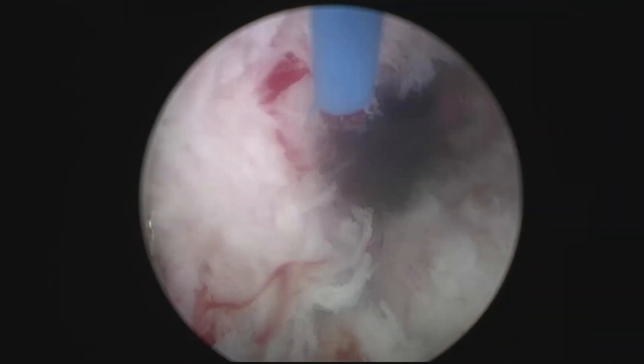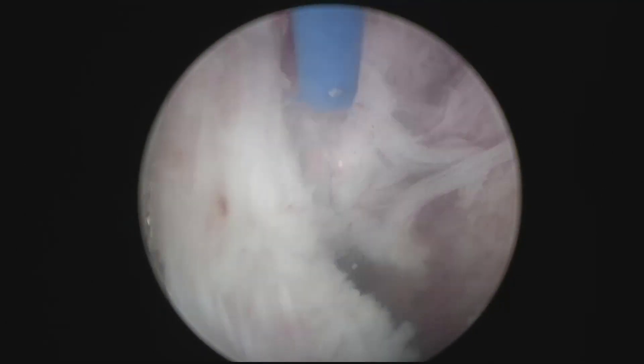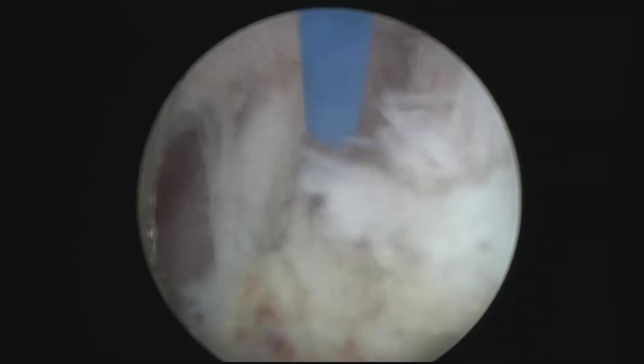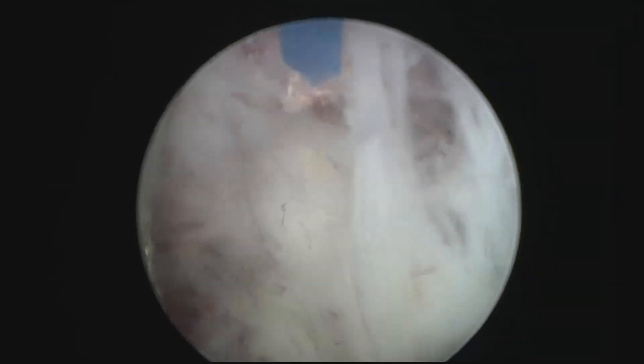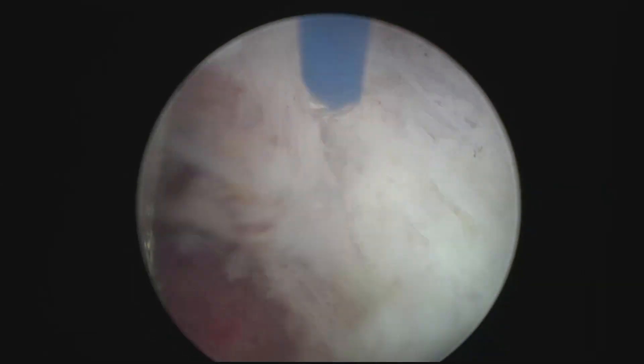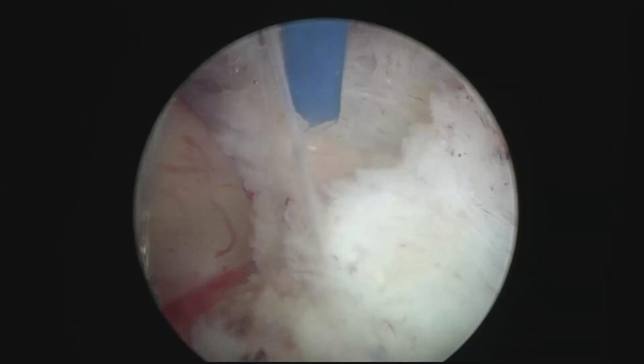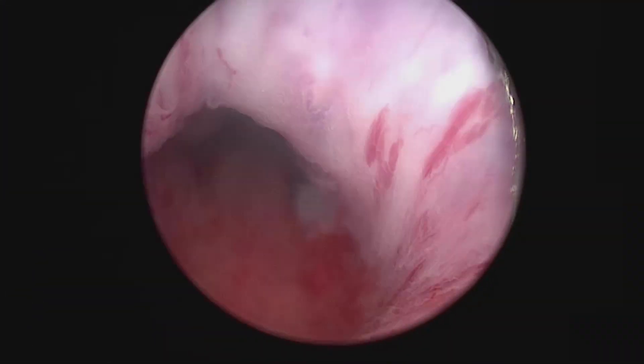The other thing that changes everything is the fast morcellation provided by the Richard Wolf Piranha system. I think this has changed our lives. Here you see the final detachment, and I'm going to show you how the sphincter looks at the end of the procedure, which I think it's a beauty. It's not even 20 minutes, I think, when the enucleation finishes. I'm not going to show you the morcellation, but there you go — that's the sphincter. Look at it. Wonderful preservation all around. I hope you liked it.